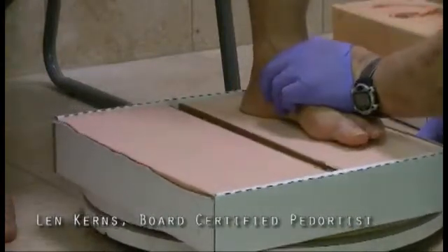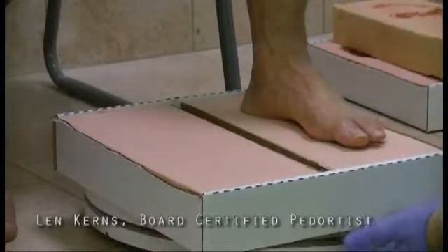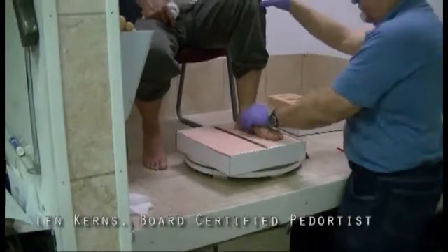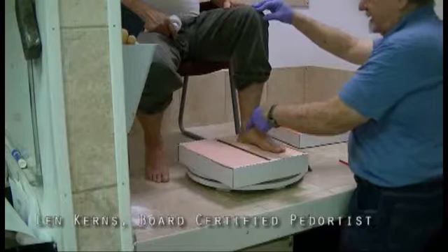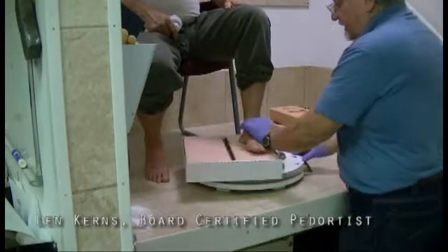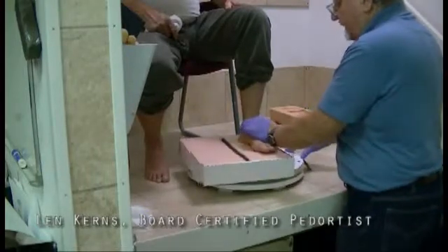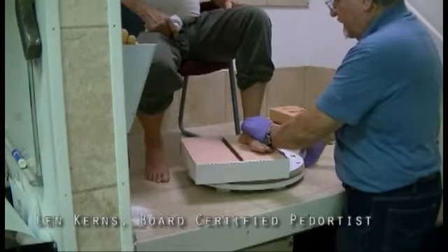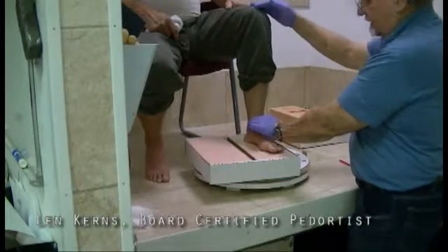So what we would normally do is line up the knee and the ankle at 90 degrees, pull this forward or back until we have it 90 degrees, or ask the patient to come forward. I'm holding my index finger on the navicular and talus interspace, and I just slowly rotate the machine back and forth. Pronate, supinate, find subtalar neutral. When you're happy with subtalar neutral, you lock the brake and make sure you're at 90 degrees.